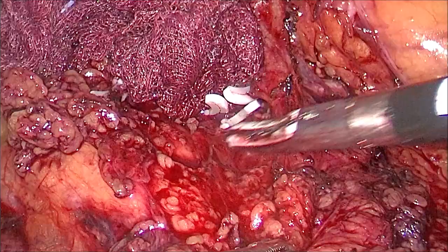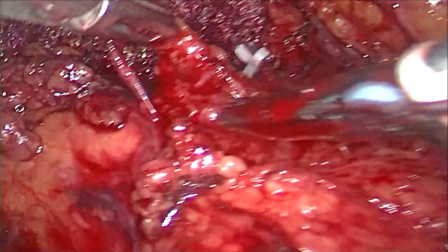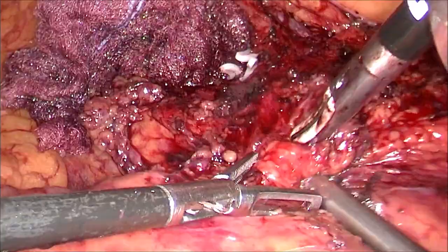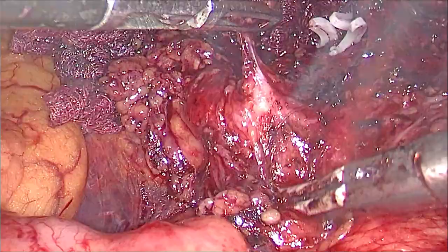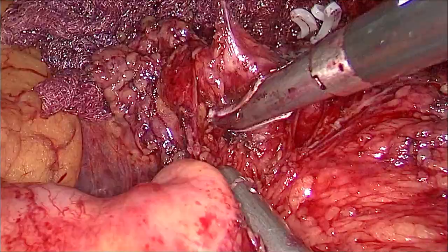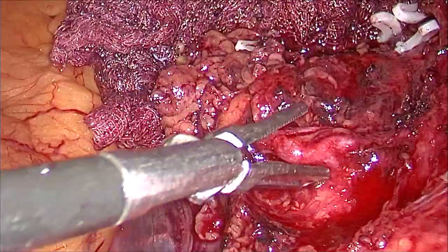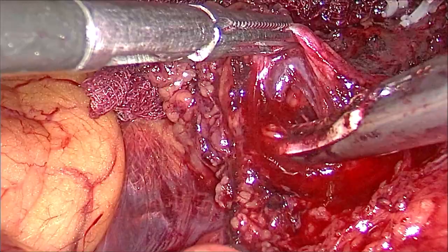That is the superior mesenteric vein and adjoining is the superior mesenteric artery. As we move caudally we will be identifying the right colic vessels. This is a slightly fatty patient, so the use of energy devices and vessel sealers enables us to dissect the vessels properly, identify them precisely near their insertion, and divide them so as to increase the yield of lymph nodes and remove the lymphovascular tissues. The right colic vessels, both artery and vein posteriorly, are being dissected, and we can see them with the superior mesenteric vein as depicted.